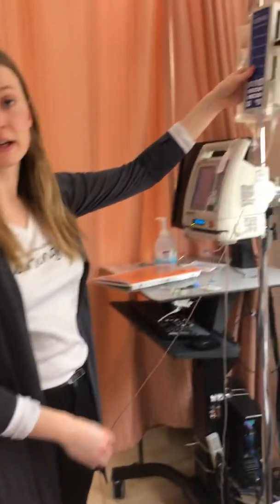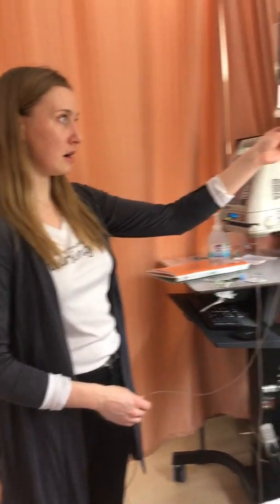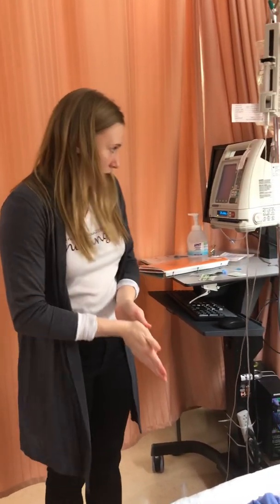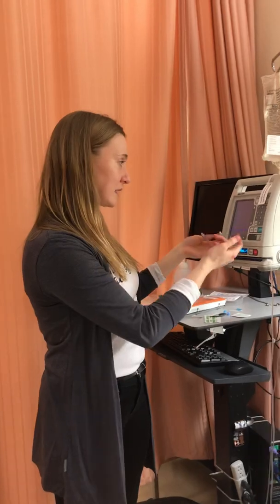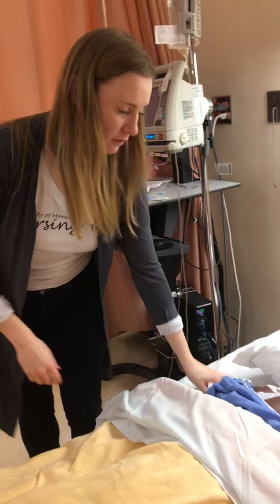Once this CIVA is complete, what I will be doing is inserting a 3 milliliter syringe of normal saline in here to flush the tubing so as to give the proper dose and IV line. Just maintaining sterility well through it all. And the last thing I can do is make sure that the normal saline that has hung is still running. It looks like it's good. I don't see any occlusions. And do my final safety check, make sure that IV is good afterwards. Thank you. That is my demonstration for today.